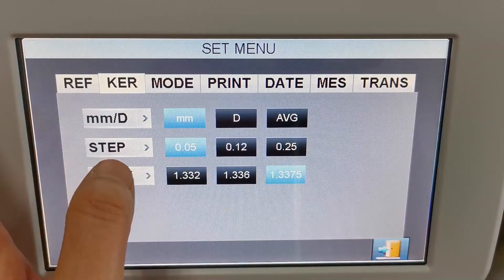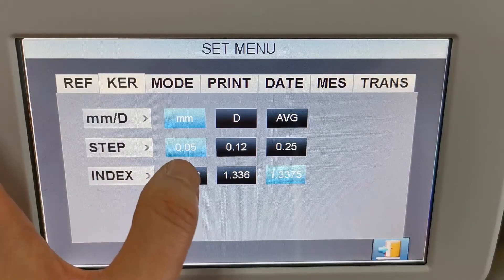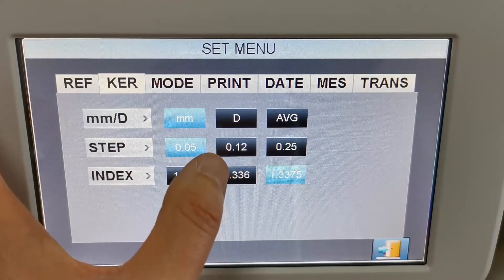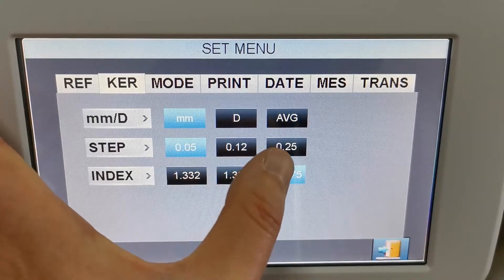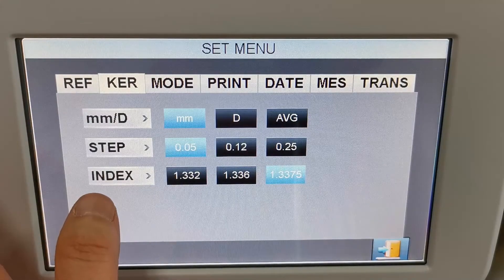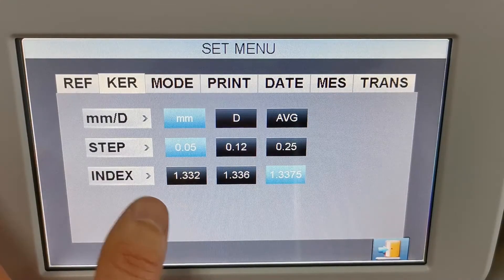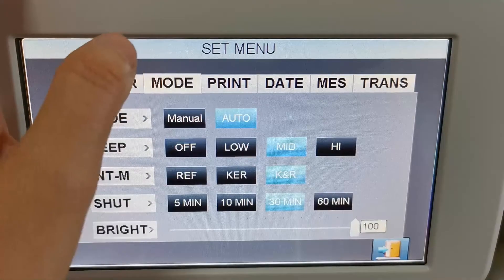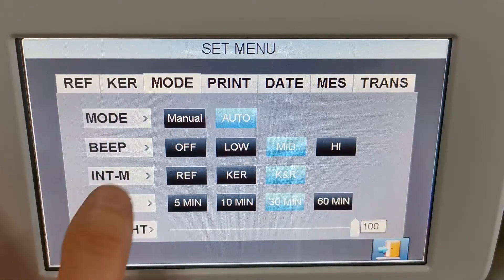And here is the step from 0.05, 0.12, 0.25. And here is the index options, and here you can change the measuring mode.